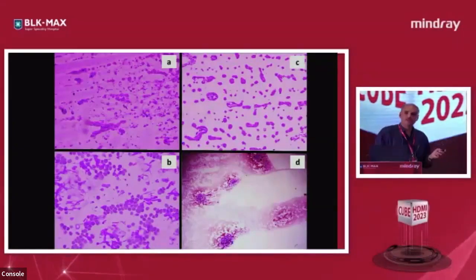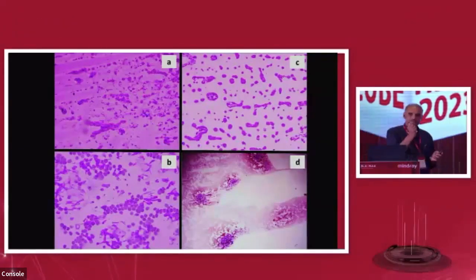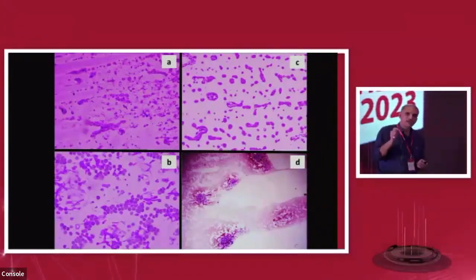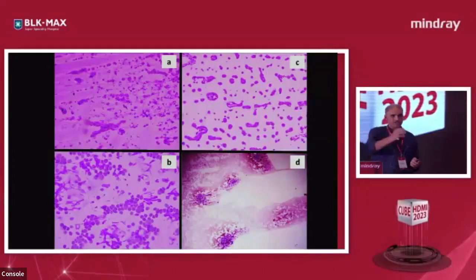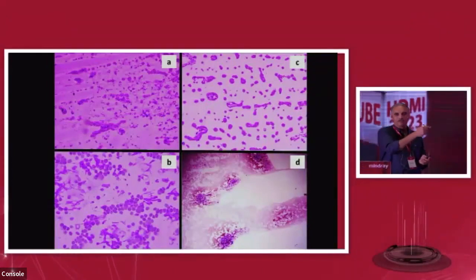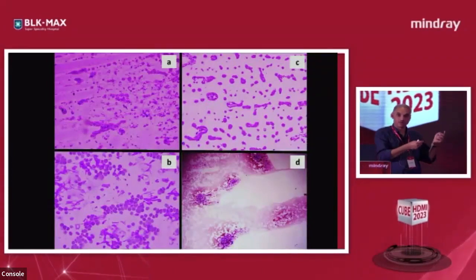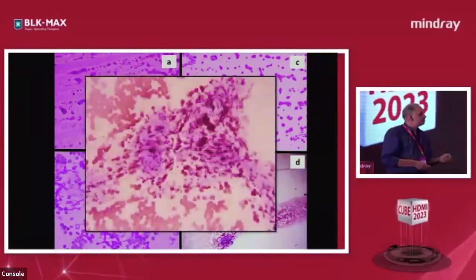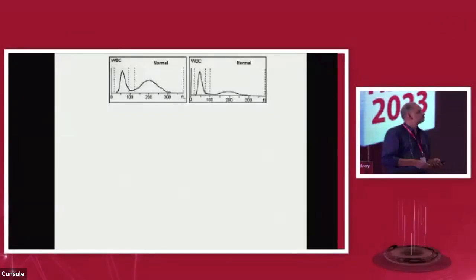So what we saw in the smear was fibrin clumps, wisps of fibrin in all these cases. And then we found out they were mostly line samples. So through these long staying cannulas, they develop a fibrin film. So when they were aspirating, probably this was coming up. All of these cases had this. That's one in higher magnification.